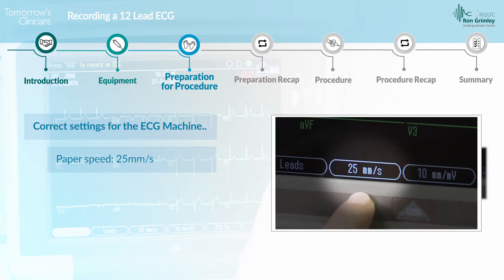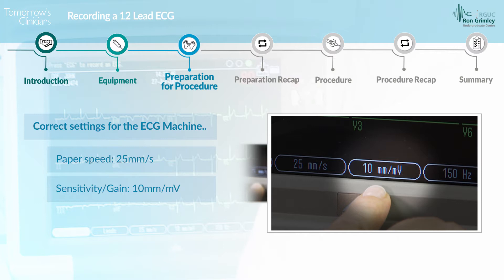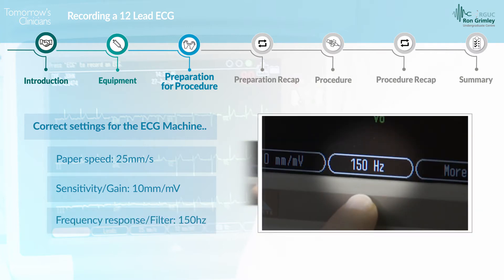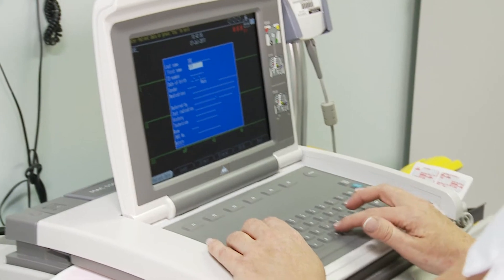The paper speed should be set at 25 millimetres per second, the sensitivity or gain at 10 millimetres per millivolt, and the frequency response or filter at 150 hertz. Enter the patient details into the ECG machine.